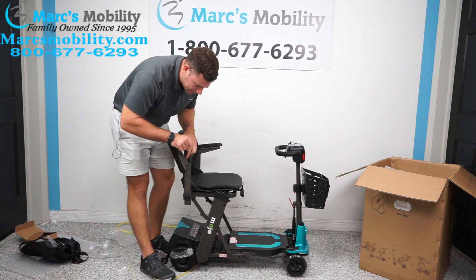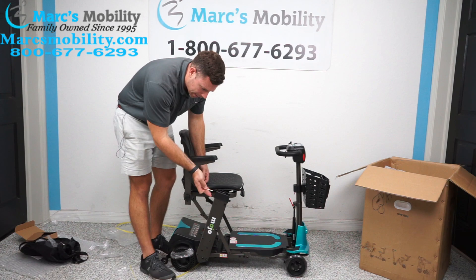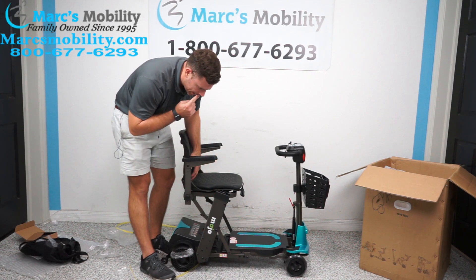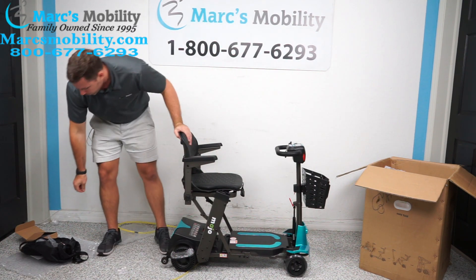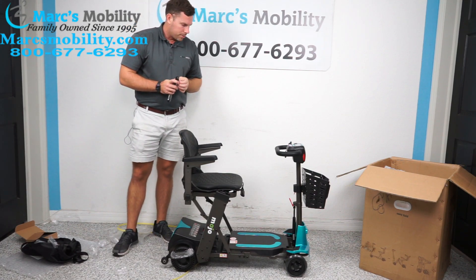You have an Allen key that you can use to adjust. The farther in the screw goes, the more downward the pitch angle. The higher up you screw it in, the higher it will stop your arm. Really, it's however you feel comfortable. You also do have a key fob with these units as well.